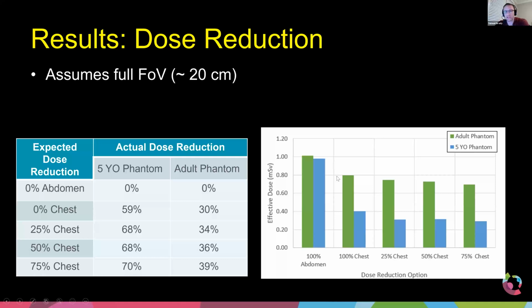The only reason I bring this up is that we're starting to do a lot more CBCT. I believe the whole field, interventional fluoro, is moving this way, and I believe we've come to that tipping point where we need to now start to ask the vendors to produce low dose, better optimized protocols for routine use of CBCT.